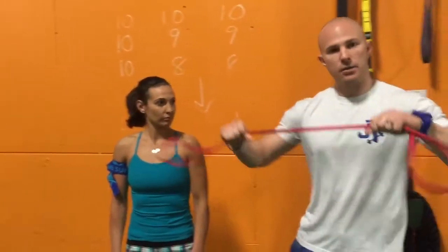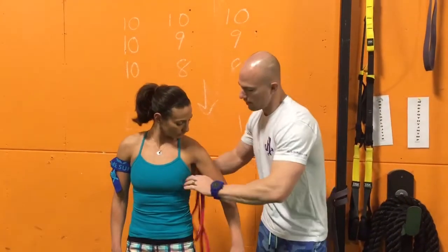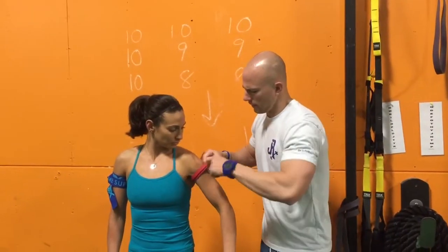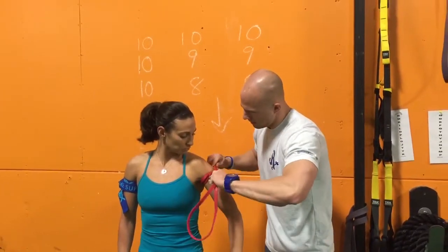If you guys don't have these cuffs, everyone has bands around. Again, we're gonna get a 7 out of 10 perceived tightness, get it up into the armpit, and simply tie it off. Is that about 7 out of 10? Okay.